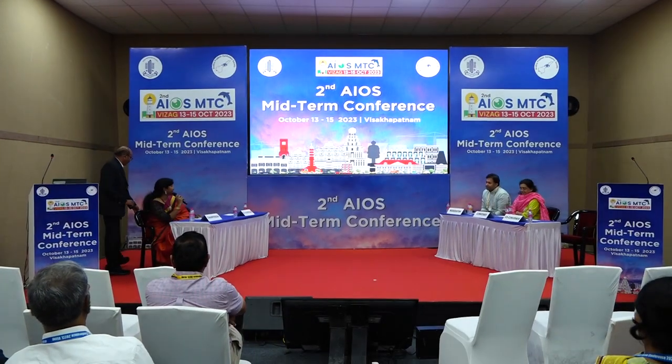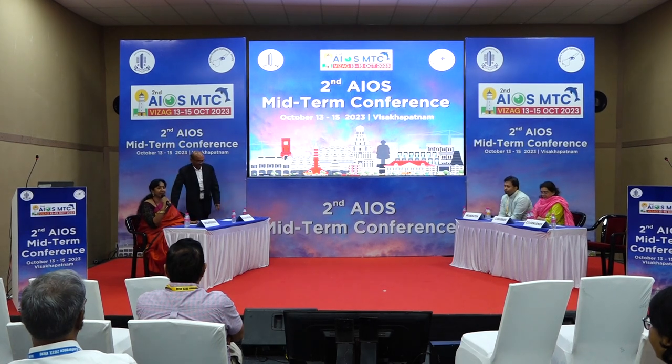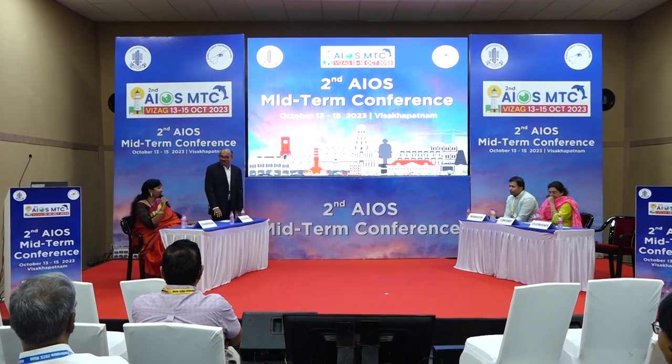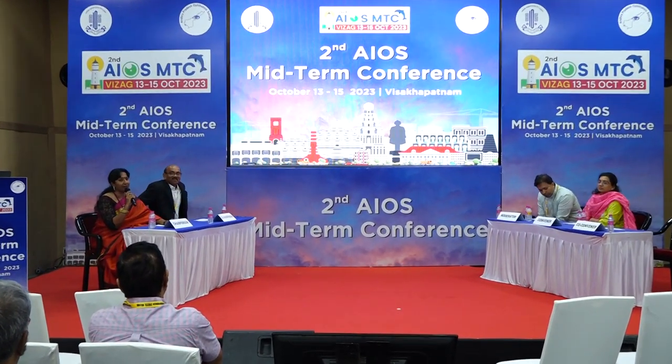Thank you, sir, for your excellent presentation. The practical tips covered in SICS were really helpful to all of us. I think SICS definitely does play a role apart from FACO, especially with hard cataracts, if you are a beginner in FACO, or where there are other complications like compromised endothelium. In such difficult cases we can definitely go for SICS. Thank you, sir. Any questions from the audience?